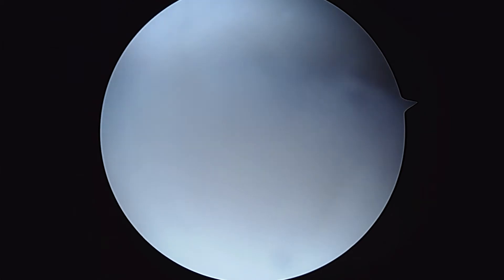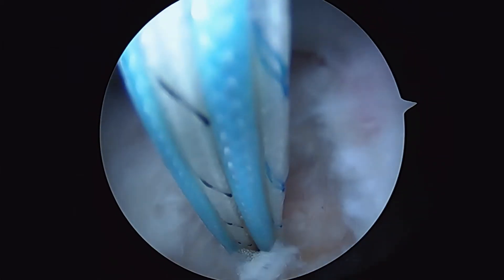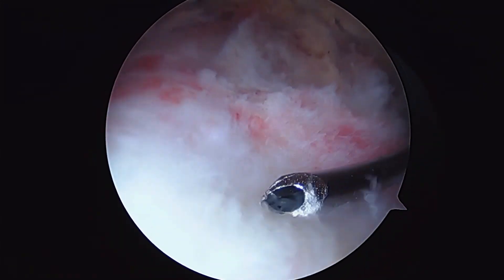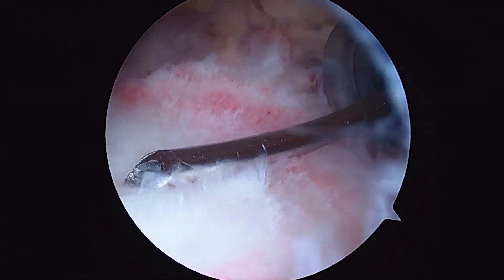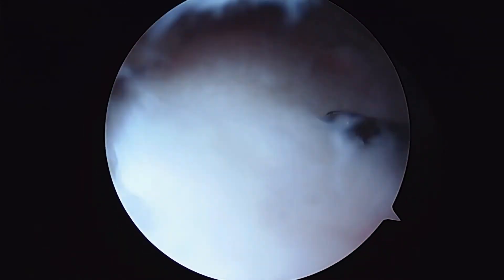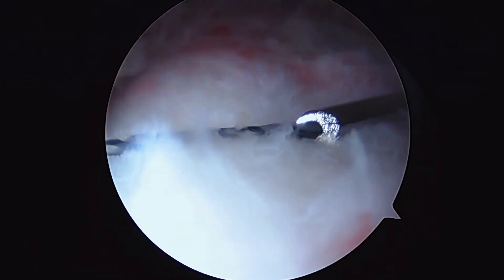Now we're going to seat the anchor by pulling tight on the sutures. You can see there's three to work with. That looks great. So here's what the suture hook looks like — it's basically just a hollow needle. It's loaded with a black wire called the super shuttle that we already showed you for the biceps work.